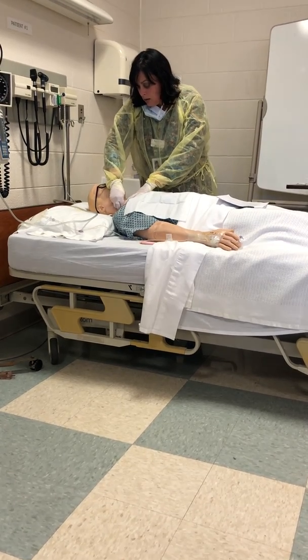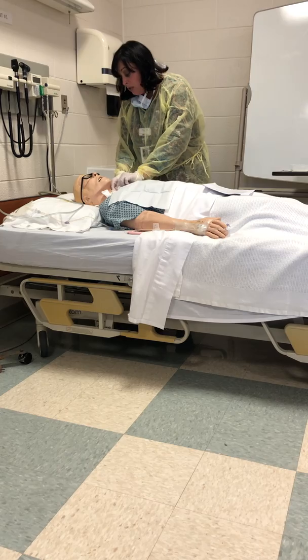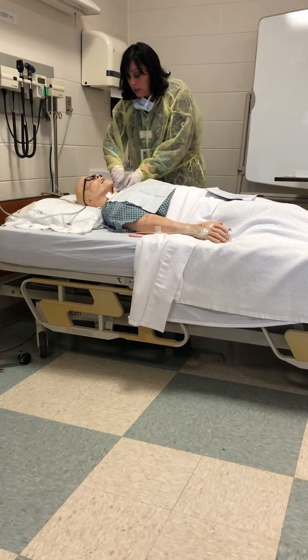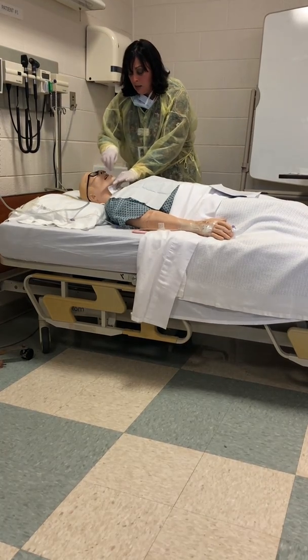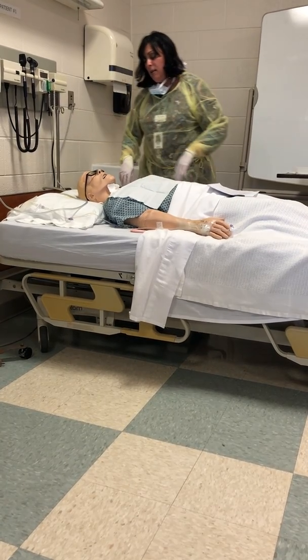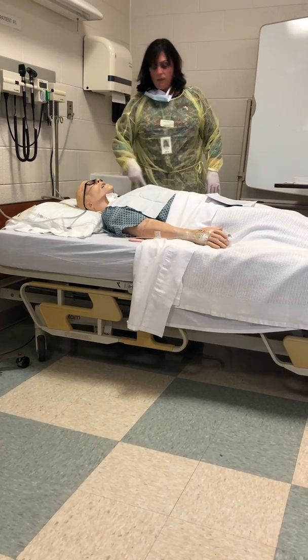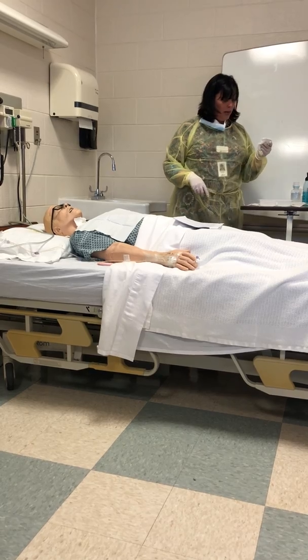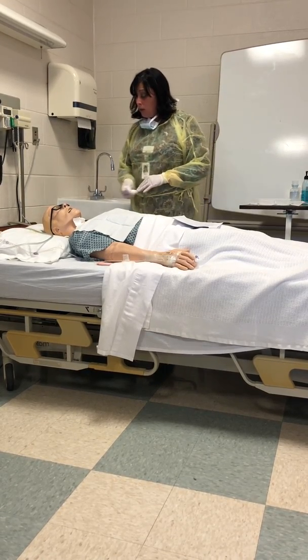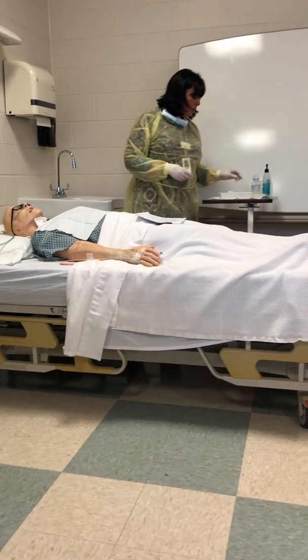Sorry, buddy. I dang near tore it out. Oh, he's decannulated. Let me get the hemostats. Open him back up. Make sure you always keep an extra trach and hemostat at the bedside in case it does decannulate, and then you can shove them down in there and open it up. Yes, please. Okay, and then you've also got this, so you can put that in some water, or if you need to clean up anything, that's good.